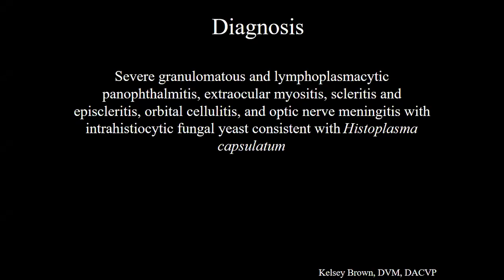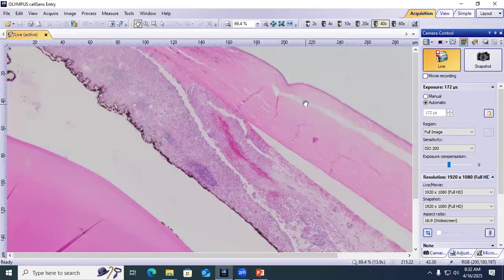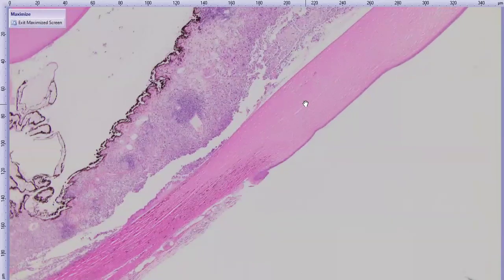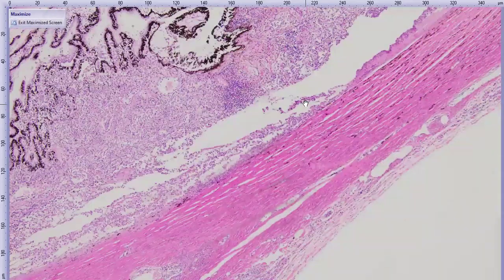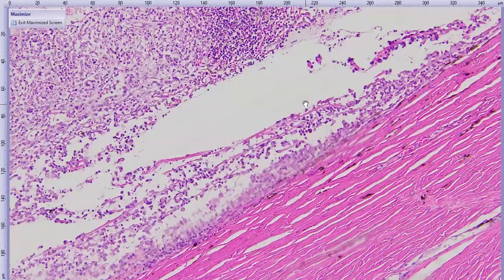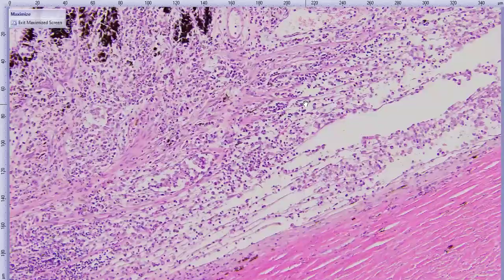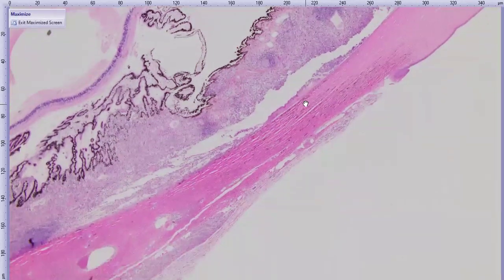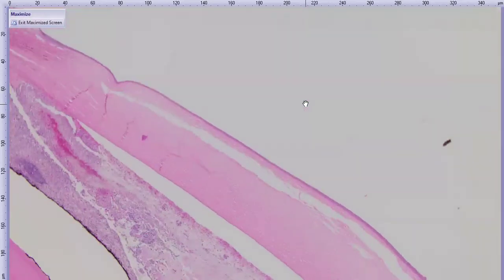Were the filtration angles plugged up? That's a good question. Question was, were the filtration angles plugged up? And I would say, it sure looks like it. Over here, there's a little bit of an artifactual cleft, so a little bit harder to gauge, but it looks like it makes up a little bit of the pectinate ligaments here, trabecular meshwork. Because it brings up the question of, if you have a chorioretinitis, is there an increase or decrease in intraocular pressure, but what else is going on? So you could have a net increase because of, yeah, it's true.